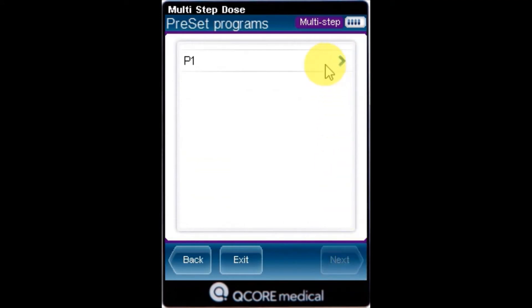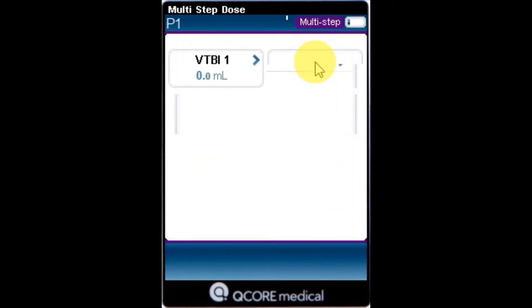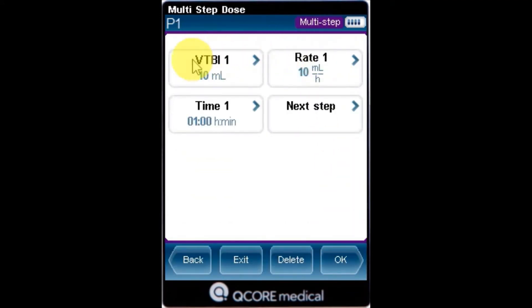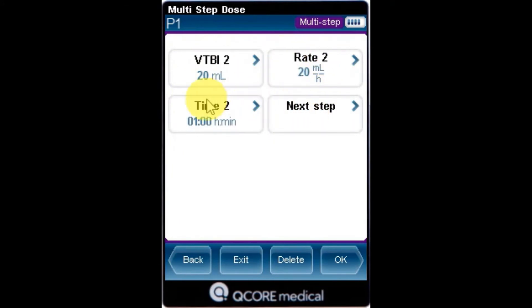From the list, select the program that you want to update, the box of the parameter that you want to change, and using the keypad, enter the new parameter and press OK.